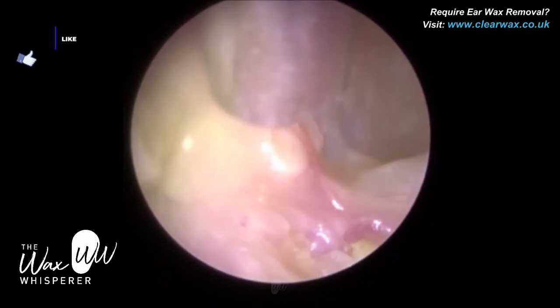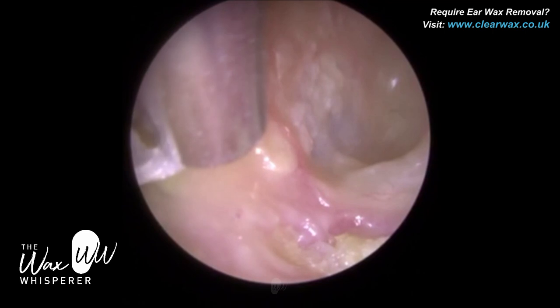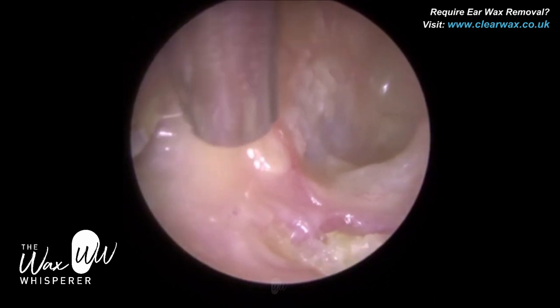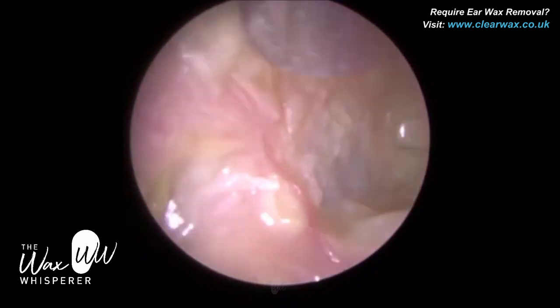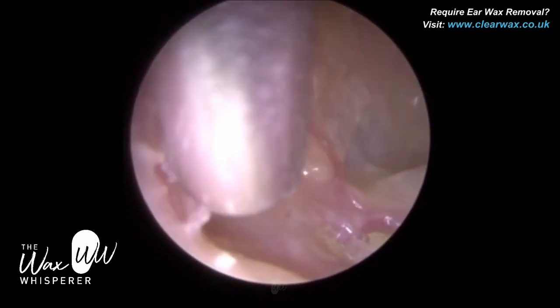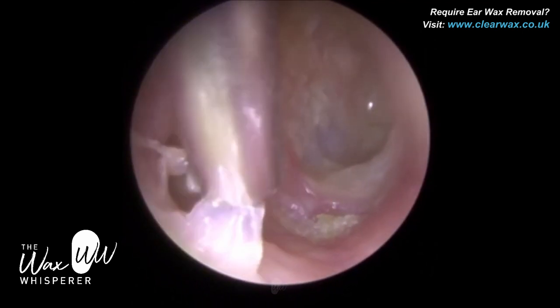We have a client here who suffers from chronic otitis externa. This is the right ear. When we show you the left procedure, the patient is suffering from granular myringitis. We'll discuss that a bit more when we show you the left ear.